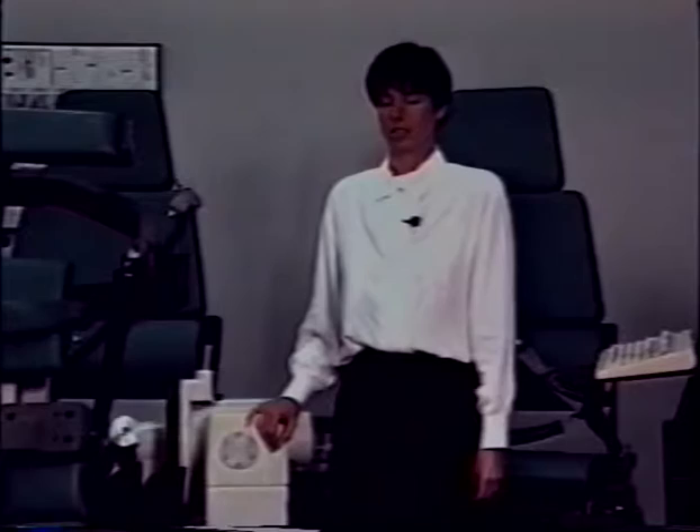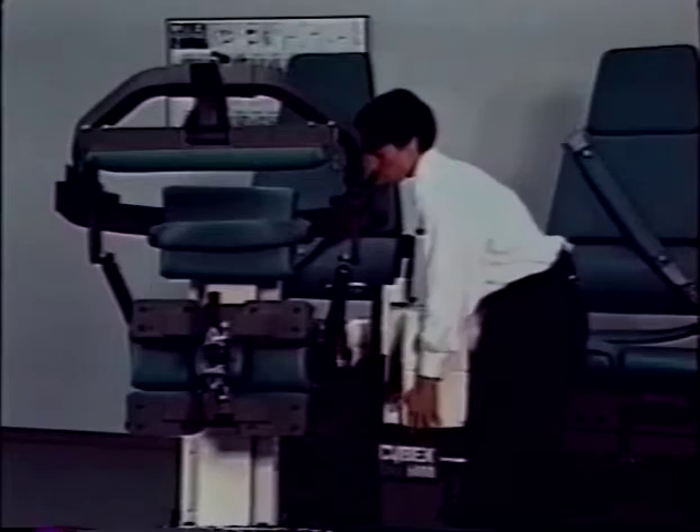To undock the TEF modular component from the Cybex 6000, loosen the dynamometer pedestal. Then loosen the knob on the dyno docking adapter. Move the input arm into the forward position and then lift up on the dynamometer until the input arm disengages from the dyno docking adapter.